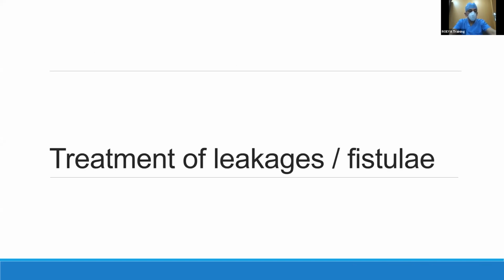Fistulas, and this is what we know and what we see every day. And it's very nice that I'm presenting today with Hani. We are very good friends, but on the other side we do this treatment of fistula totally differently. Hani always uses the fully covered stent. I follow what I have learned in Brussels, the stent in stent technique.